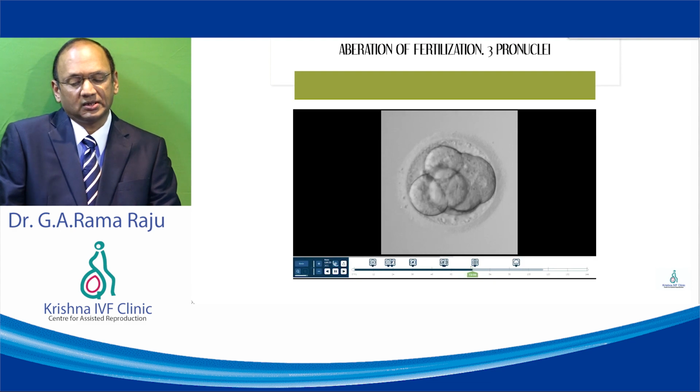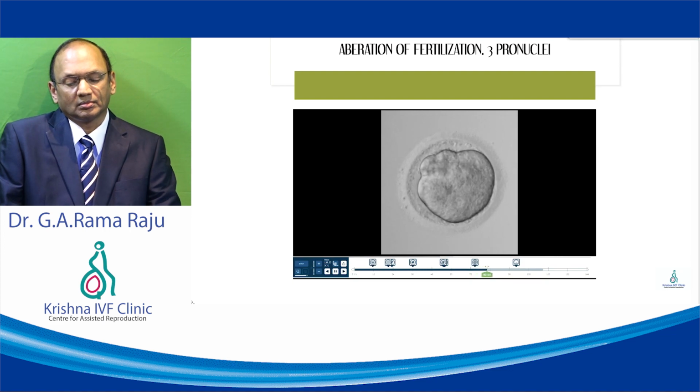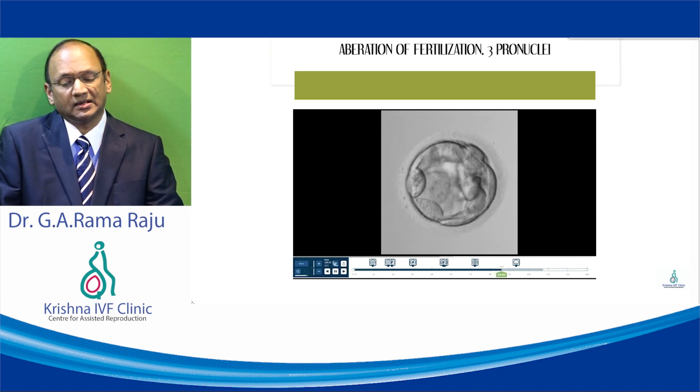You see a compaction, and later you will see a beautiful blastocyst. And all of us, when we look at these photographs, will say it's a beautiful blastocyst, and we did not get a pregnancy.